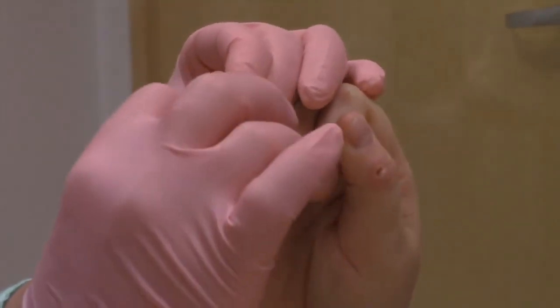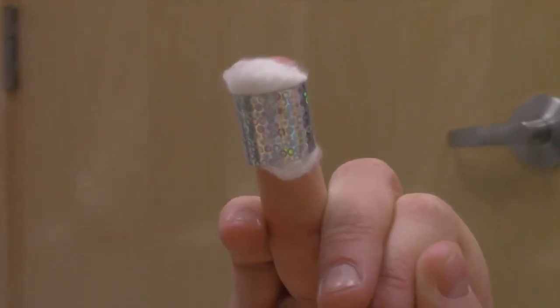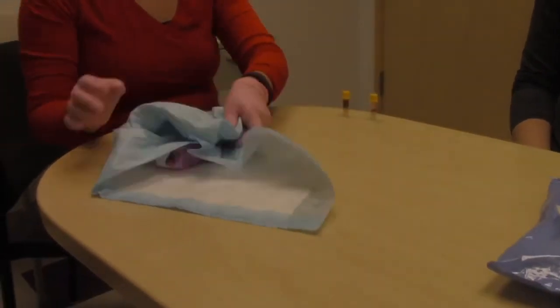When you are done collecting the sample, clean the fingertip, then place the cotton ball and band-aid on the finger. You can throw all of the supplies from the finger poke in the regular trash.